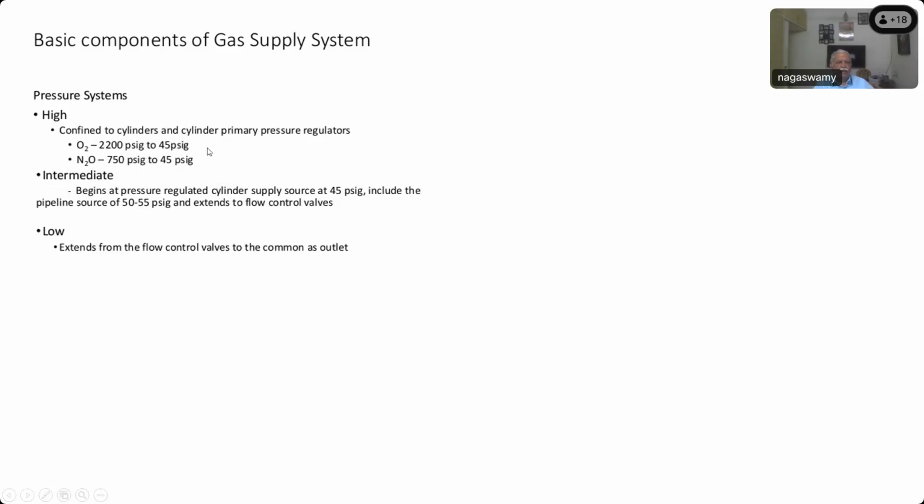So after the gases are utilized, this gauge needle will come and drop to 0. So when the needle is showing 0 on the pressure gauge, does that mean there is absolutely no oxygen at all inside the cylinder? No, sir. There will be some amount. There is still some oxygen present. Even when the gauge reads 0, there is some amount of oxygen left inside the cylinder. Why is it not coming out? Because it has equaled the atmospheric pressure, sir.